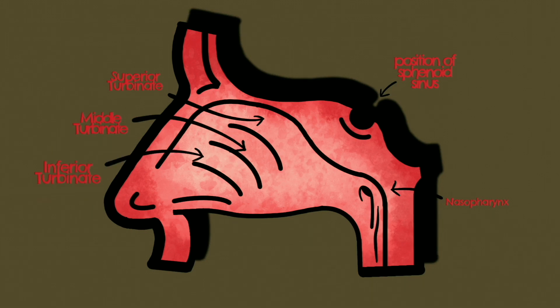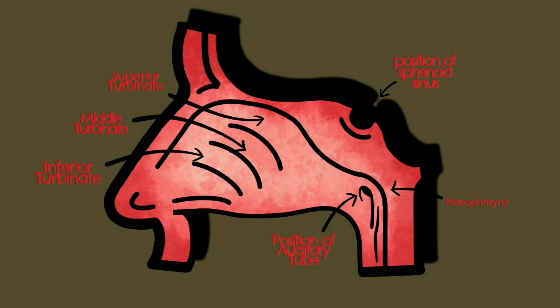The inferior turbinate is the largest. At the posterior lateral aspect of the nasal cavity we can see the entrance to the auditory tube. This tube links the nasopharynx to the middle ear. If this tube is to become occluded, the patient would suffer from otitis media, which is inflammation of the middle ear.